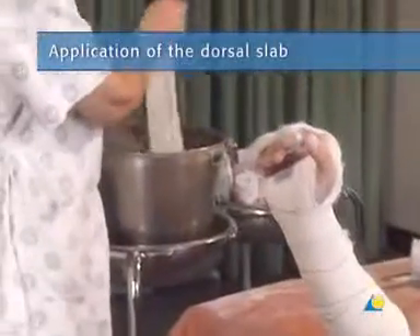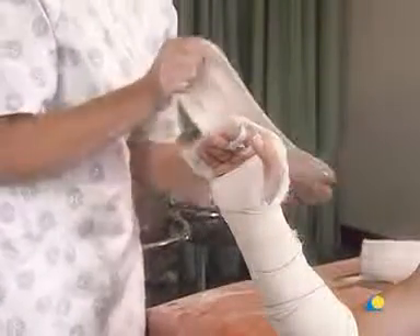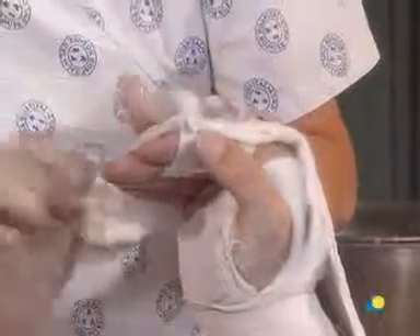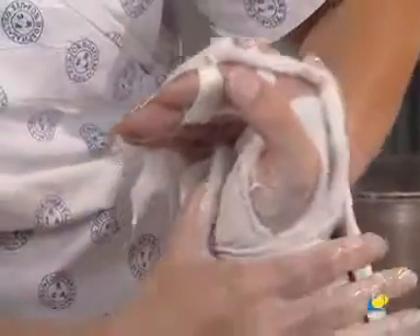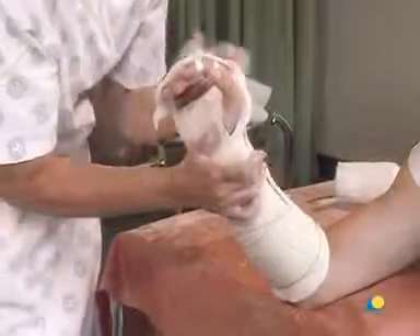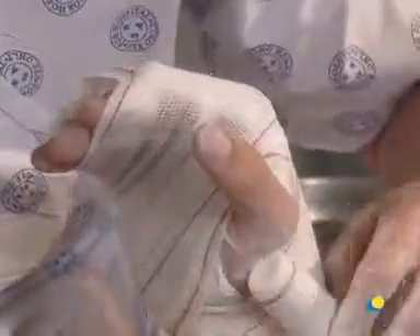The second slab is wettened and applied. At the distal end, the MP joint must be splinted to a flexion of 90 degrees to prevent stiffness. The splint should be well molded to maintain the reduction, with support under the metacarpal head. Dorsal molding will correct any dorsal angulation. The second slab is secured in place with a crepe bandage, which is wrapped around the forearm, passing through the first web space around the fingers to be secured, and around the wrist.